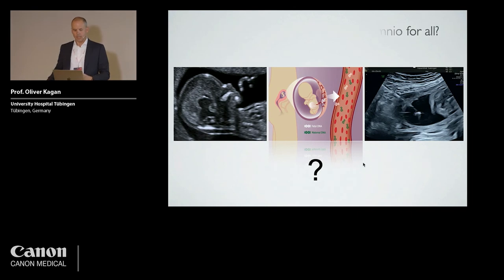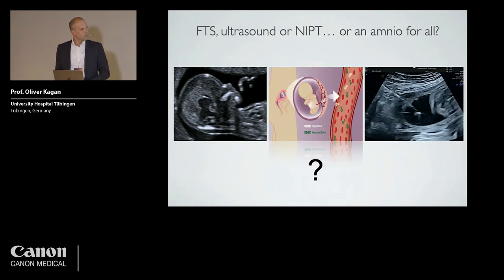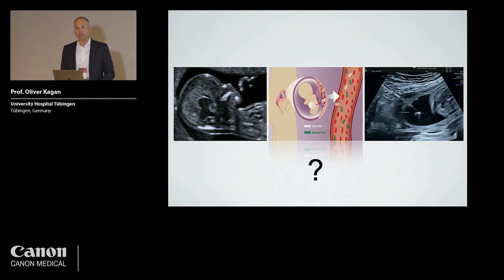So with all these different aspects, what shall we do? We've got the nuchal translucency, we've got the combined testing, we've got NIPT, or we could even do an amnio in everyone, isn't it? That would be a completely different approach, and it was discussed some years ago: why don't we do an amnio in everyone and see what we get, if the risk for miscarriage is so low, more or less 0.1%? Well, obviously patients don't want this, and we decided not to go along this way, and NIPT is so much more comfortable. But still we need to ask ourselves, how do we combine these different tests?